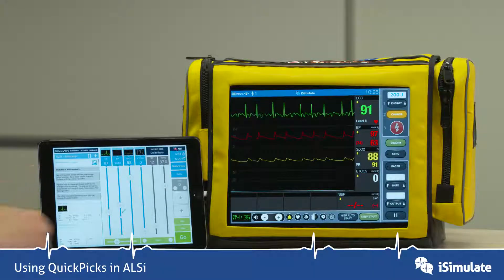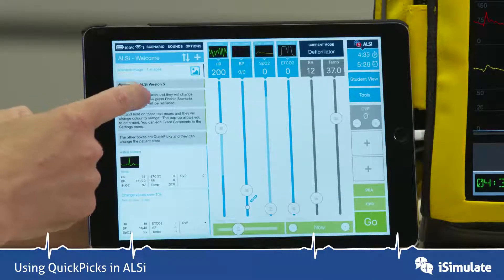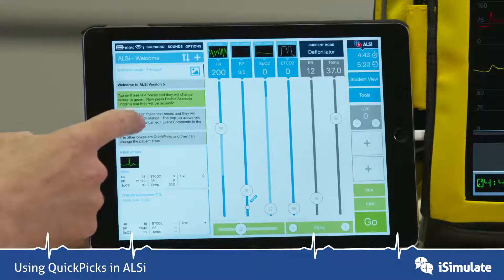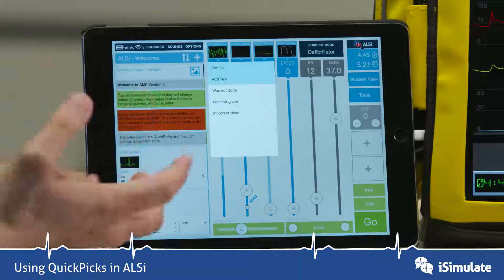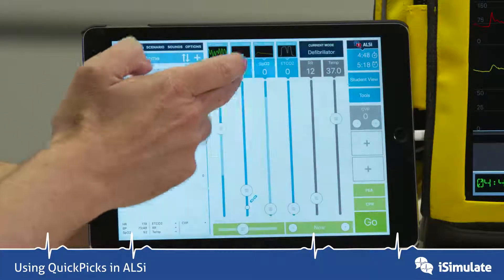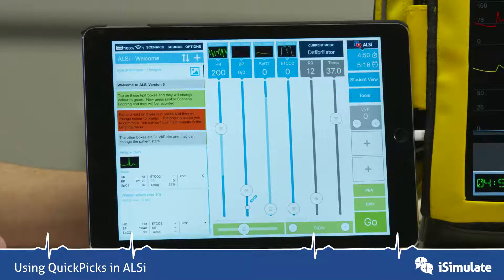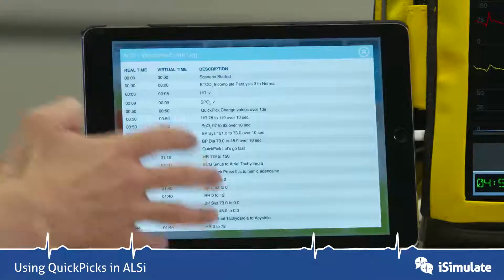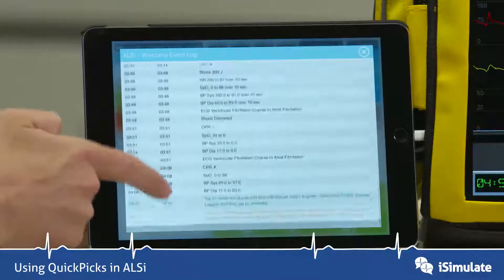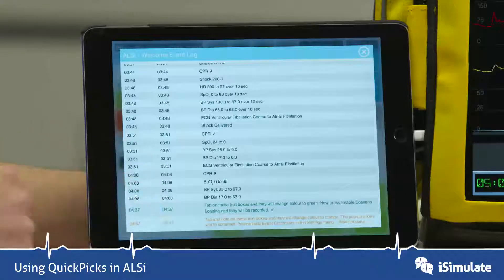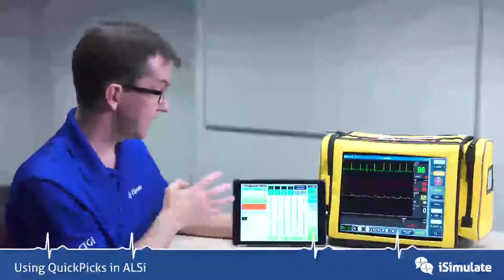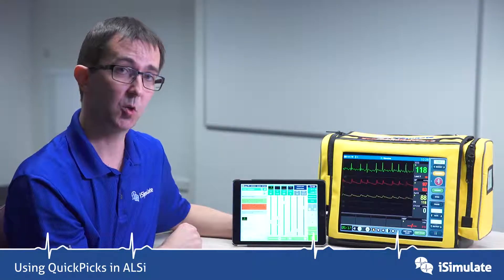I'm just going to show you what the text boxes can do. These are just information that you can use during a scenario. You tap on the grey box and it turns green to show that it's been recorded. If you tap and hold, it goes to orange in the negative, and you can make various comments such as 'was not done.' If you now go to the tools button and tap on view log, you can see that this has recorded all of these events that have occurred, including the text boxes. You can export this log at the end of your scenario. And that's a quick look at the basic functions of QuickPix.